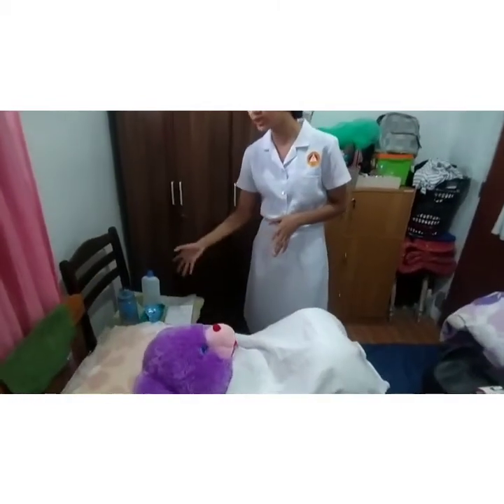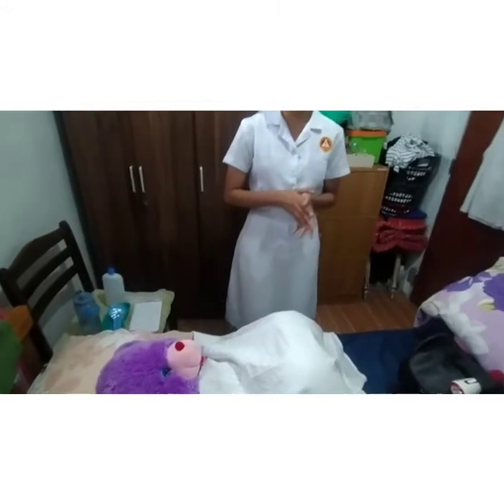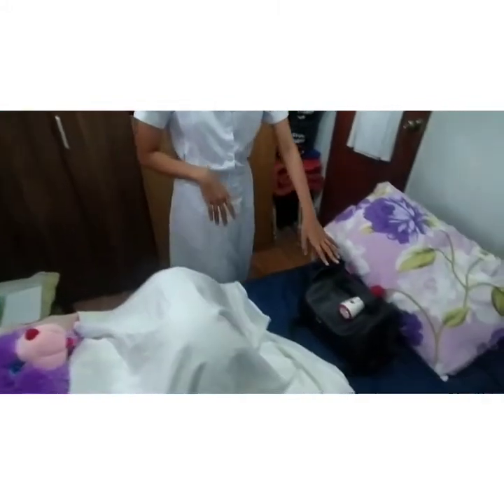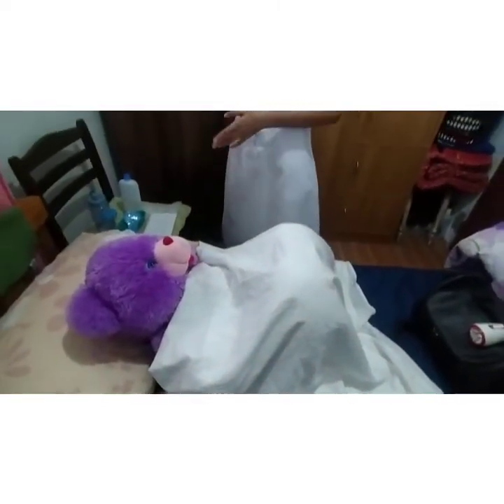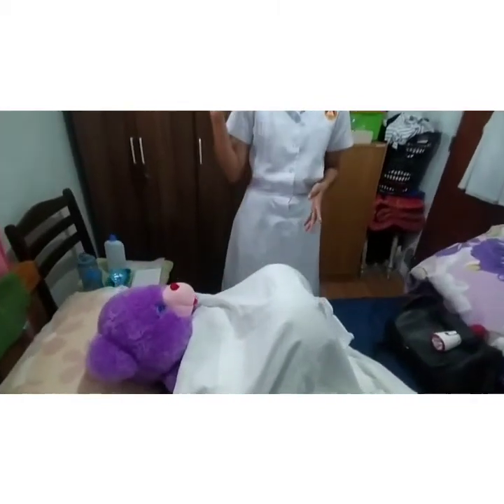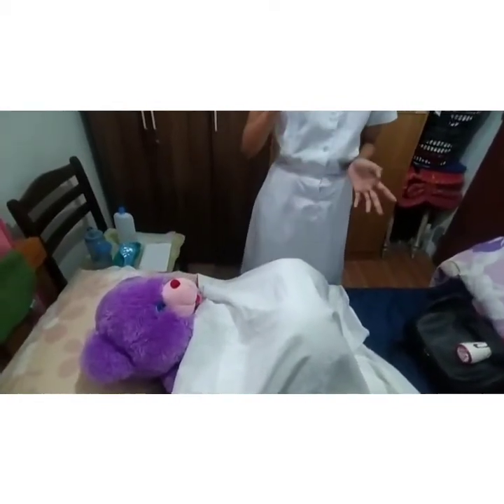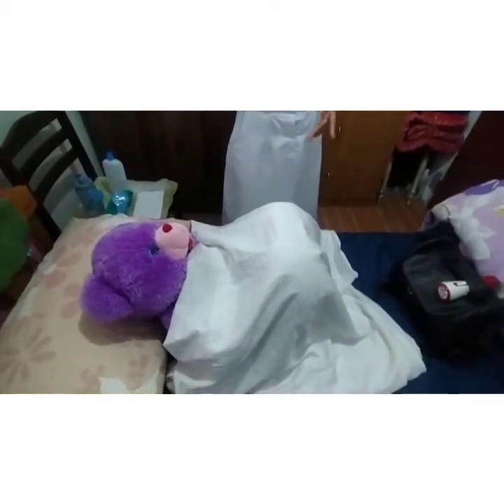We have here the equipment needed for the procedure we will render to the patient: the perineal heat lamp, the blanket, and the perineal flushing set. I have here some of my equipment, and after that, check the clinical equipment for defects.